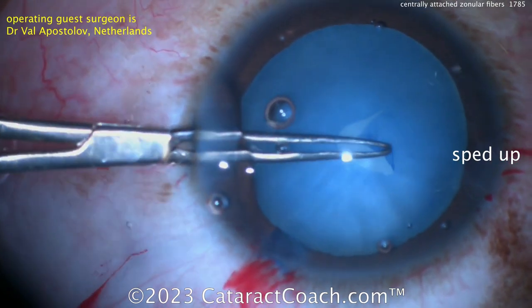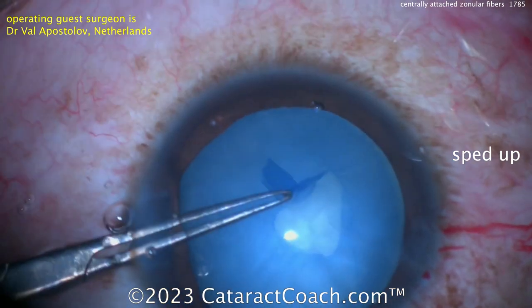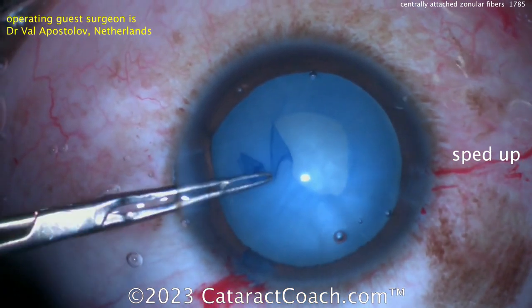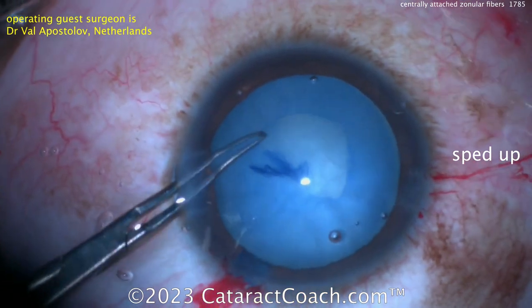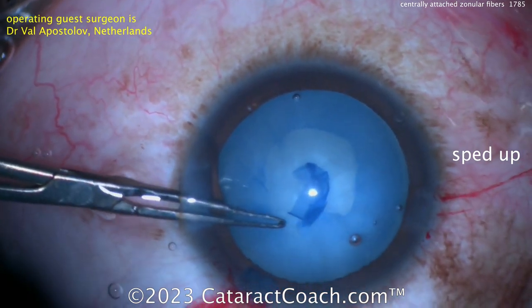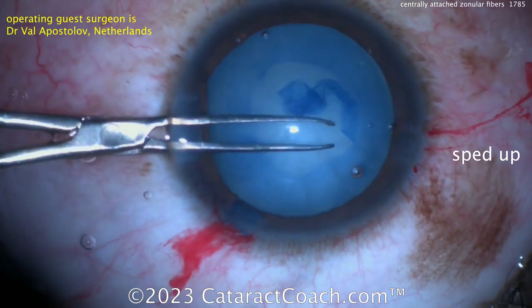To do the rhexis, watch this. As the rhexis starts to tear, it comes on and hits that anterior zonular fiber, which is very much anterior, very central. And look, it gets stuck. So he has to pull the other direction and then go past that one. The goal is obviously to make that rhexis just inside those attachment points. This is a very unusual case — the rhexis may end up smaller than you anticipate, because you really don't want to get stuck on that zonular attachment point. It will not allow the rhexis to go past or through it, so you'll have to go inside of it.